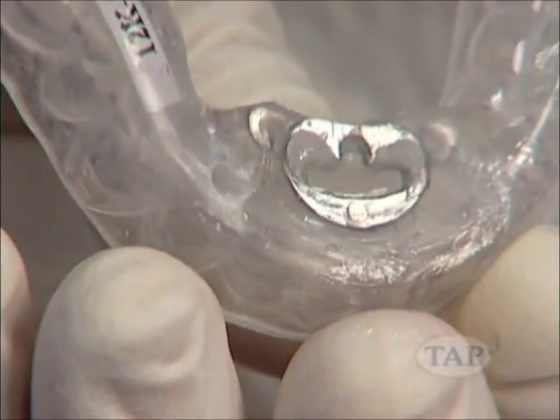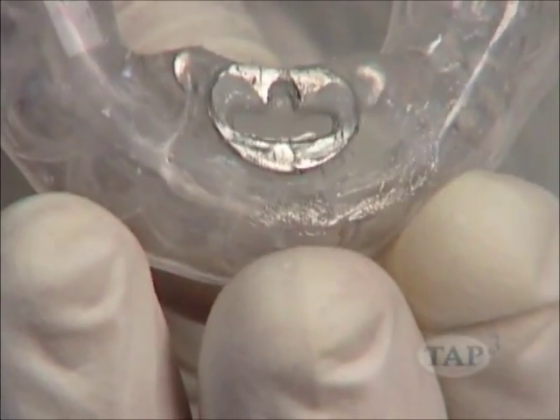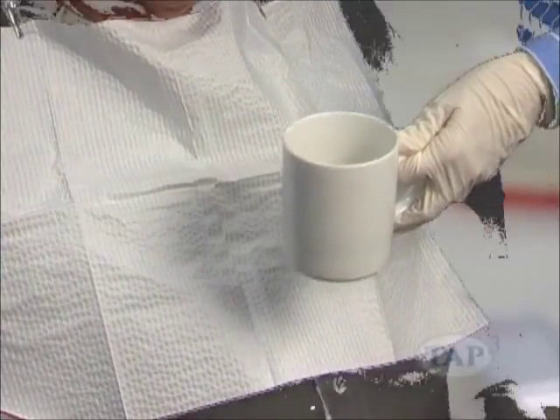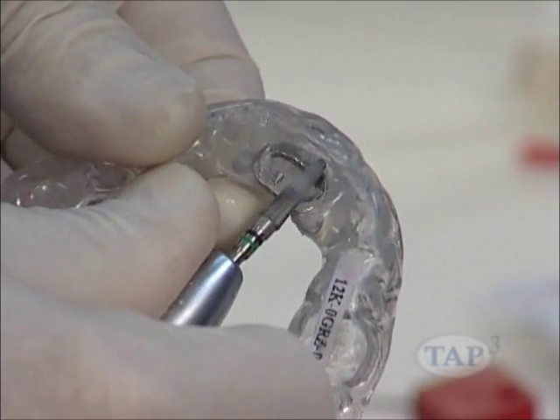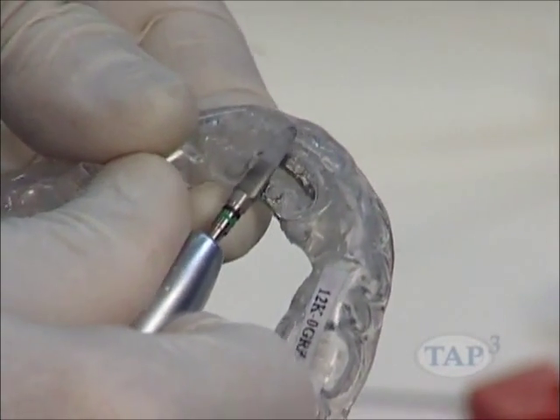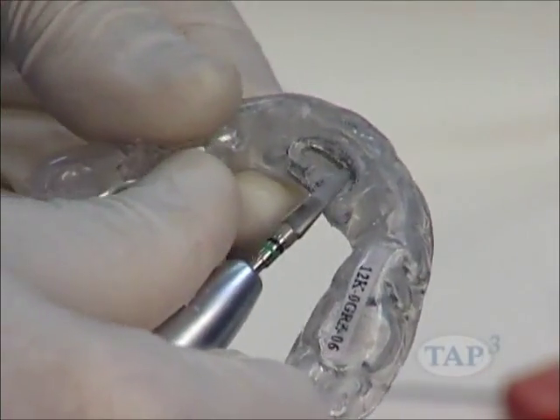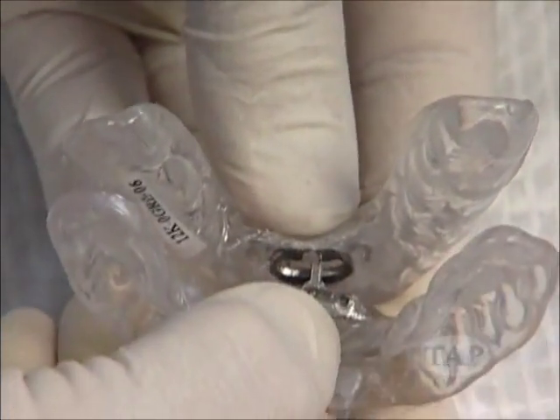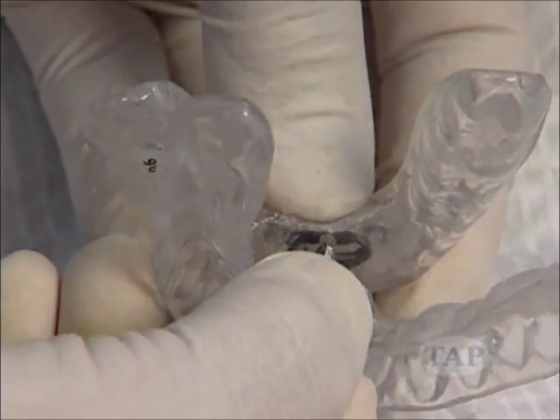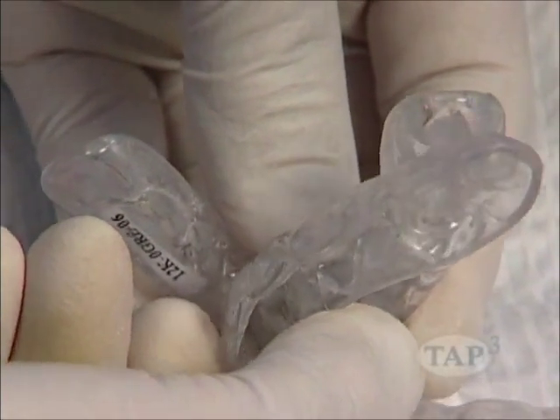Turn the upper tray 90 degrees in relation to the lower tray to disengage the hook. Again, leave the notch filled with acrylic. Cure the lower tray in hot water. Once the acrylic is set, trim and smooth the acrylic, and then polish it. Place the trays together by turning the upper tray 90 degrees in relation to the lower tray.